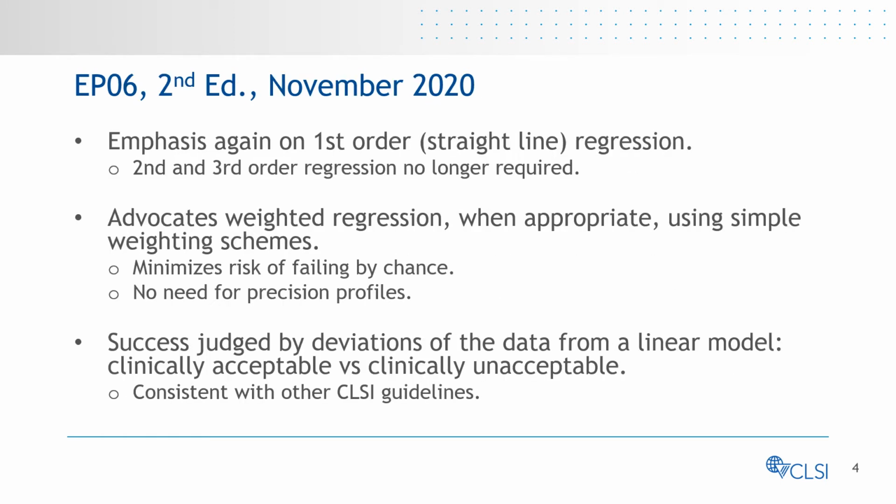The new version recommends using linear regression statistics, using weighted regression when appropriate. The linearity interval is the range of measurement values that includes all data points that are clinically acceptable.